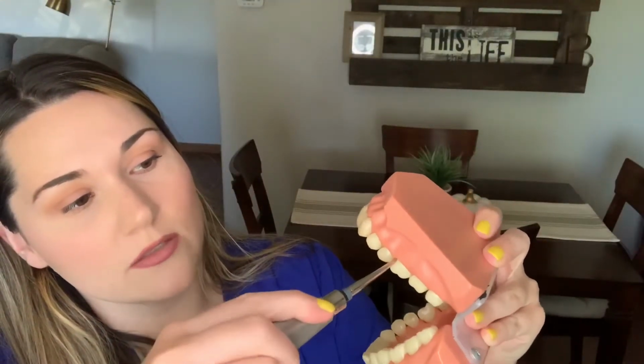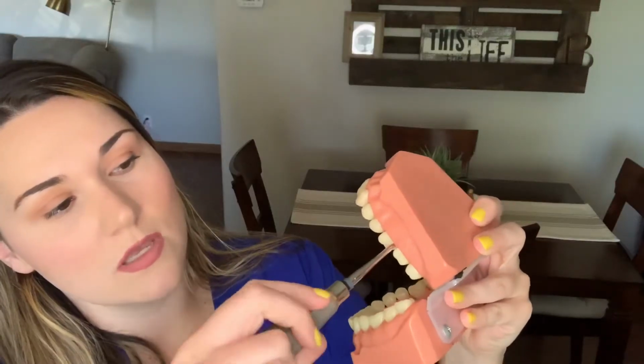He'll do the same thing. He will try to loosen it in the socket, because the goal with this step is you want to be breaking off those ligaments that are attached to the tooth. You want to be loosening the tooth in the socket, getting the gum tissue away from the tooth, just creating that it's loose in the socket. So once he feels that he has done that, he'll ask me for the forceps.